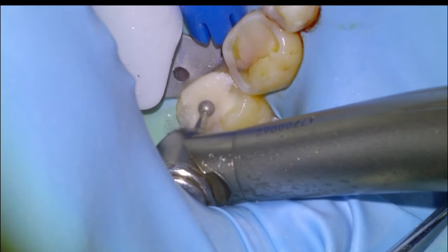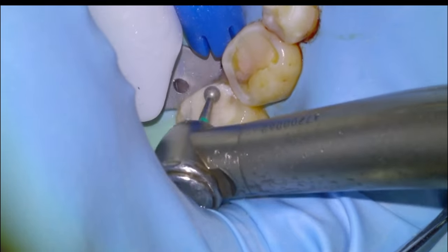You can see that there's some wear on the 4-6 as well, an existing occlusal composite. That little dark area near the distal was not soft whatsoever or tacky to the explorer, so replacement of that restoration is not indicated.